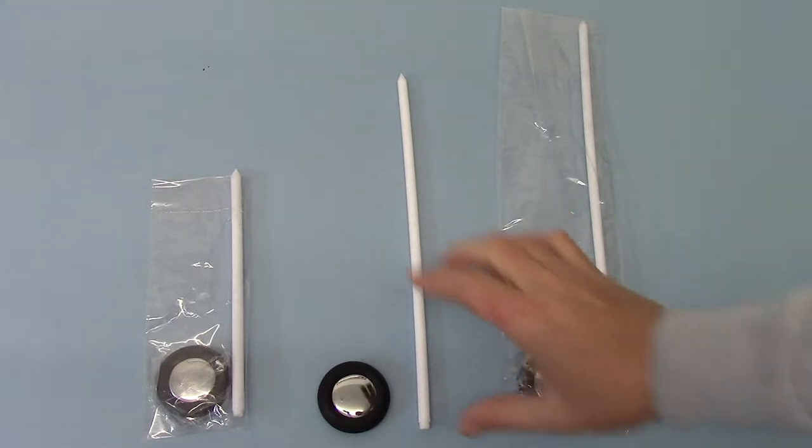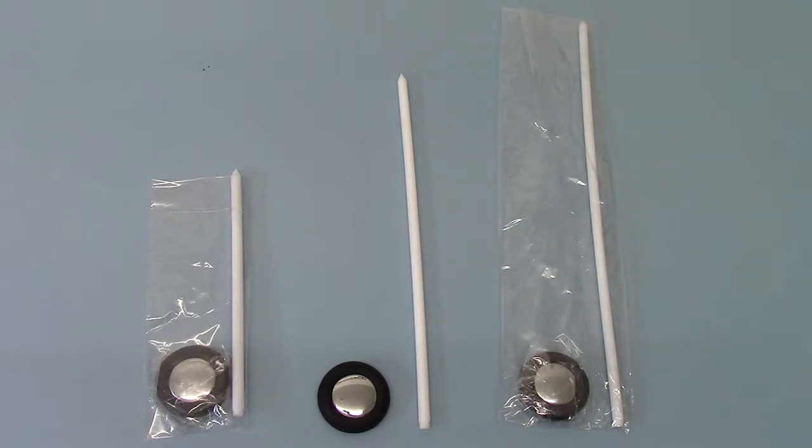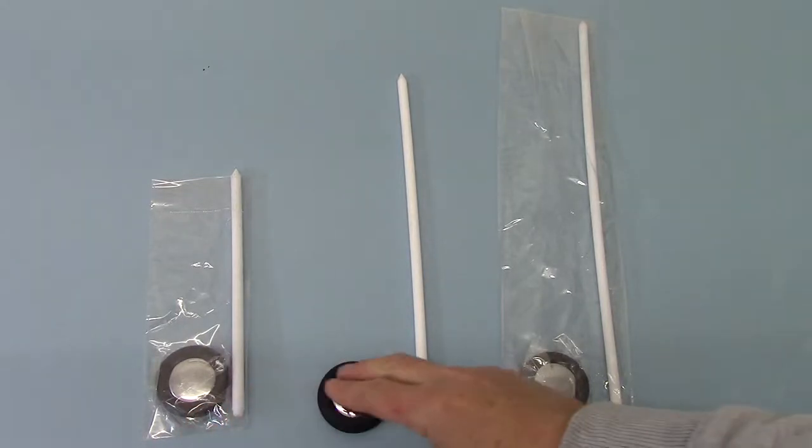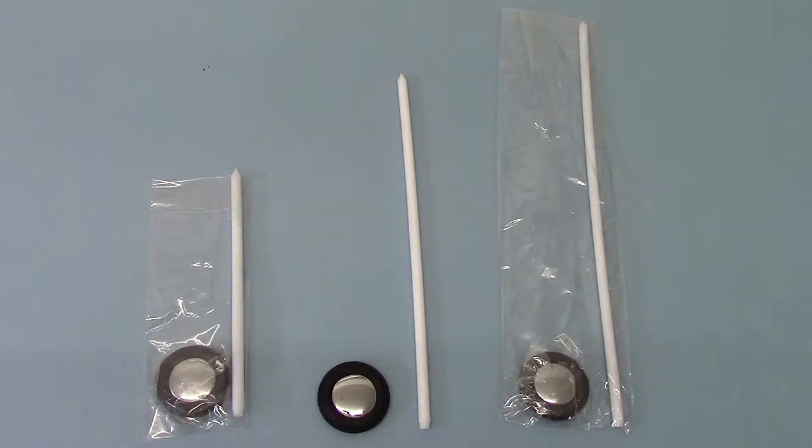Handle length does vary slightly, but it's approximately an old metric foot handle length. On the left you've got the shorter compact version, which is a 21 centimeter handle.